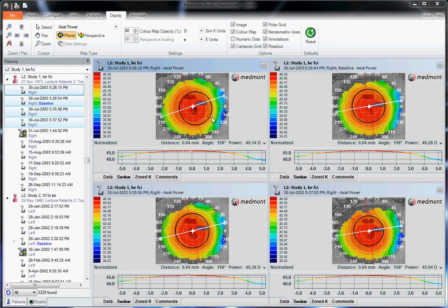This video reviews the post-orthokeratology analysis that you might do with your Medmont E300 corneal topographer. Start by selecting the best baseline map for your comparison or subtractive map.